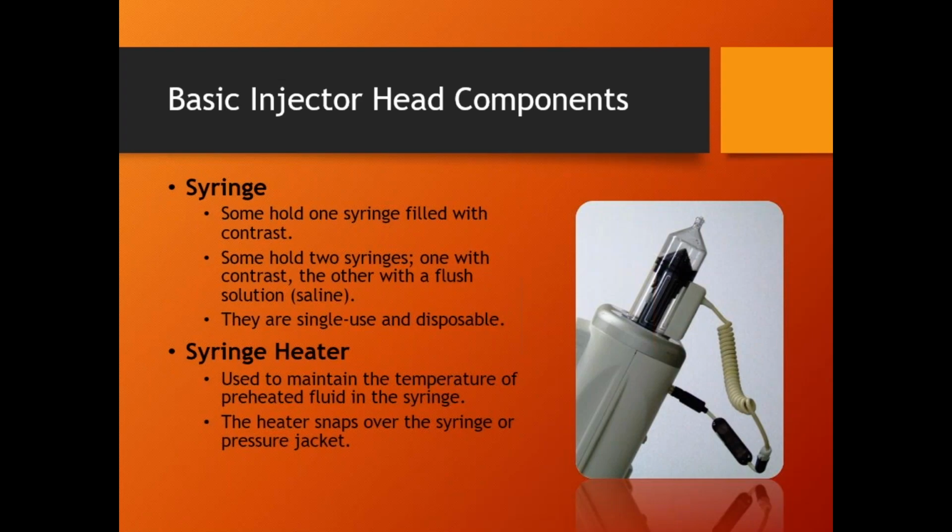The syringe heaters, I mentioned that earlier. They all look basically like this, and they all do that, and then they'll plug in somewhere in the back of the injector. And again, that heater is just there to keep the contrast and saline warm. Now, one of the things I mentioned earlier was that we keep the contrast warm because there is a slight syrupy texture to it. If they're attaching a heater to the contrast, they're most likely also going to attach one to the saline, because sometimes, and I'm going to talk about this in a minute, they'll shoot contrast and then they'll shoot saline to follow it, one after the other.